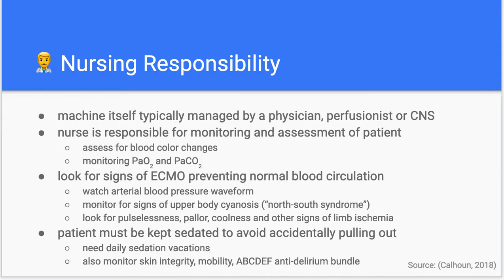Typically, it'll be a physician, or there are dedicated folks called perfusionists that get training in how to operate these ECMO machines. Some facilities I found do have training that will allow a bedside RN a chance to manage it. But usually in those situations, there'll be one RN that's managing the ECMO machine, potentially multiple ECMO machines for multiple patients, and there'll be a separate RN that's assigned to the patient for all of the other assessment and nursing duties. So it's a pretty team-based approach. So that's important for the nurse to know.